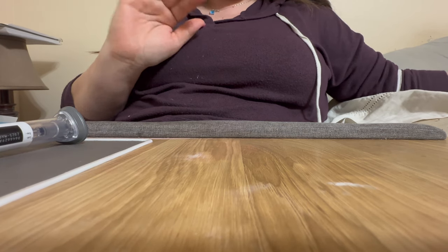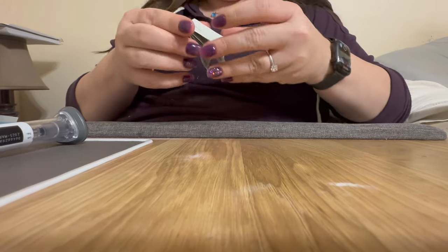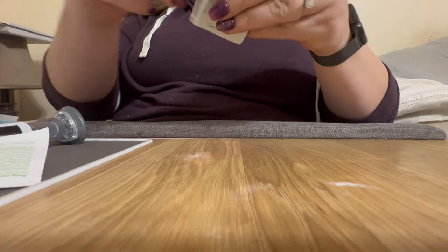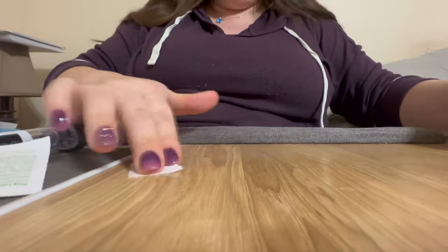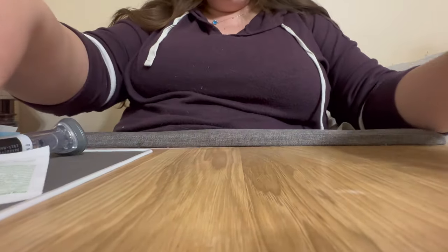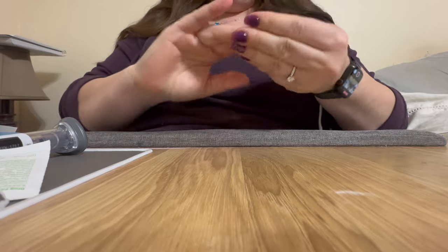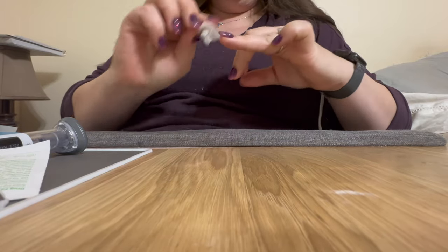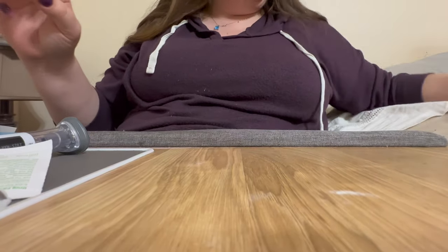First things first, you want to make sure you have freshly washed hands or you're using gloves. You want to make sure your surfaces are clean. I use alcohol prep pads to make sure everything is clean — even though none of my materials will be touching this surface, I'm going to give it a good wipe down anyway. I just washed my hands but I'm also going to give my fingers a good wipe down, because you'd want to be careful when you're working with things you're going to be injecting into your body.